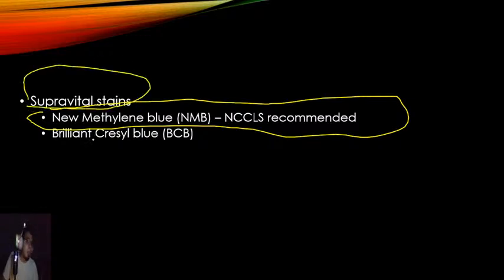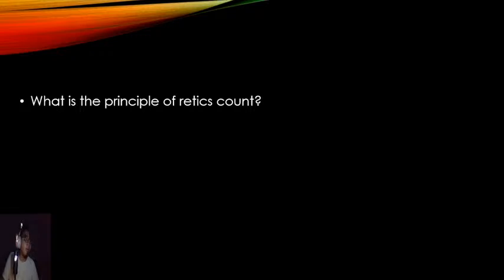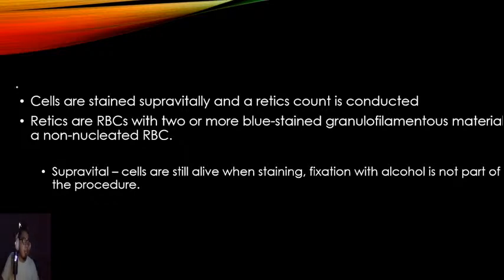Retic count, what else? Supravital staining, just for you guys to be reminded of the difference or the similarities. Okay, I can use them interchangeably, especially for hematology. Okay, now principle of retic count. It's a bit wordy, so I'll just read it out for you guys.